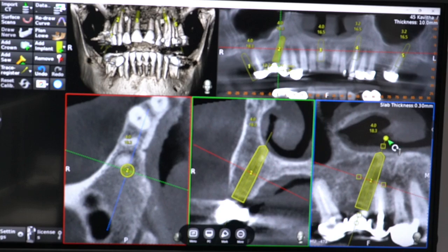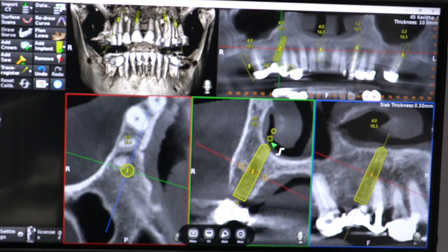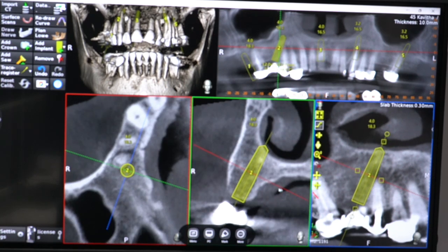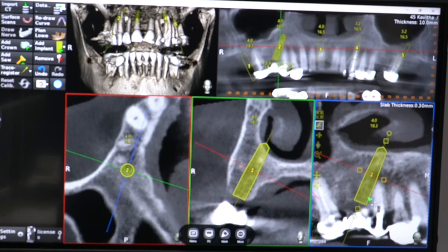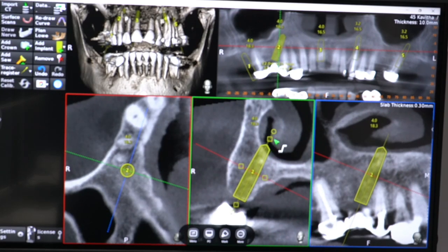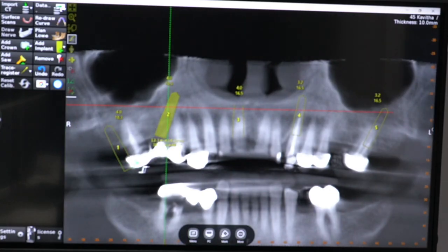Okay, but the difficulty is in the access for implant placement. That is one challenge, but there is good bone here. We can tilt the implant from the first molar also, but we have to check the smile of the patient. If the patient is having any gummy smile, then we may need to give 6. Already the patient was having 7.